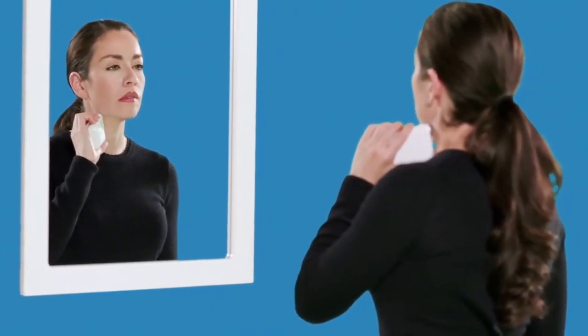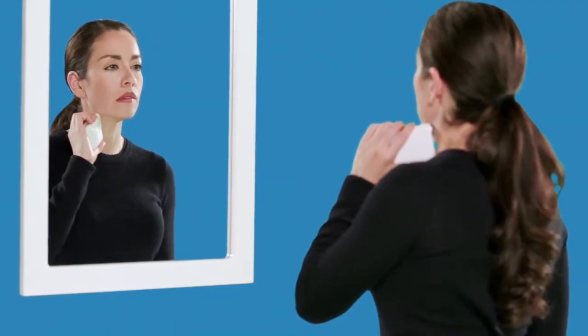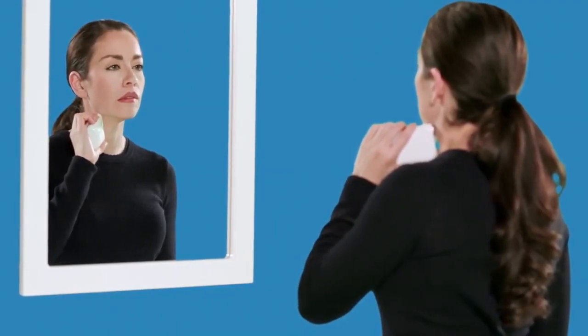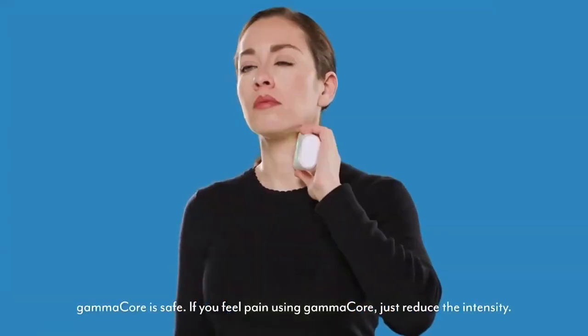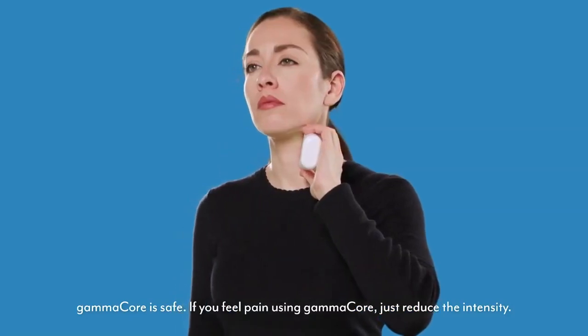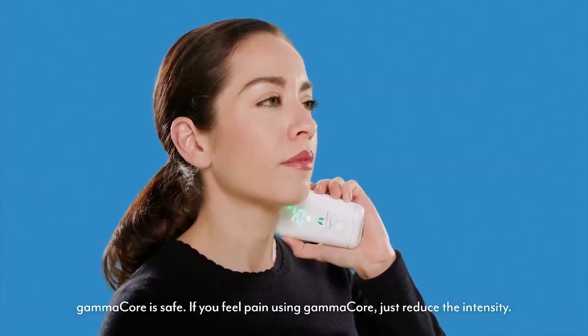Your effective intensity level may not be the same for every stimulation. Feeling the strong vibration and the muscle contractions or lip pull is more important than the actual number. Also, there is no harm in increasing the level beyond 25 or when you feel the lip pull. If you start to feel pain, simply press the bottom of the control button to decrease the intensity.